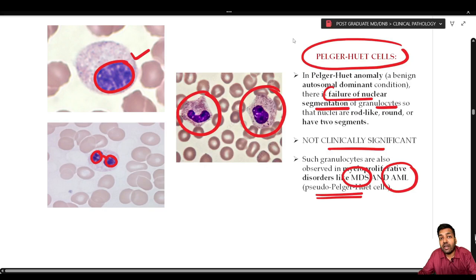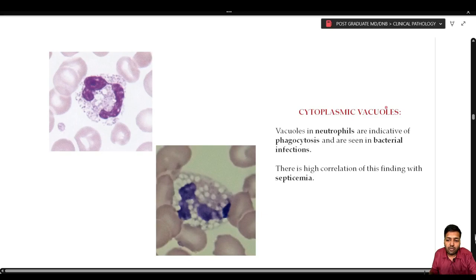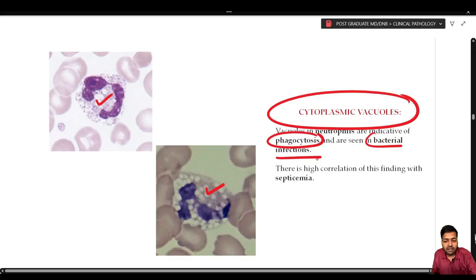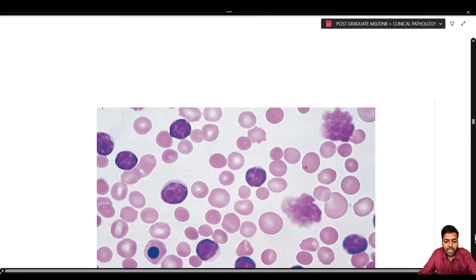Sometimes multiple cytoplasmic vacuoles can be appreciated in neutrophils, which are indicative of active phagocytosis and are seen in bacterial infection. There is a high correlation of this finding with septicemia.